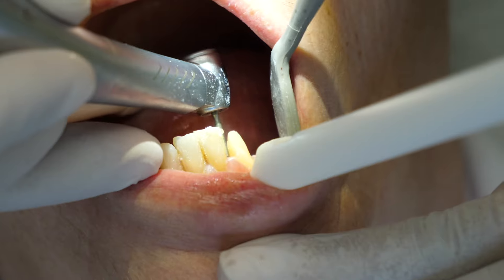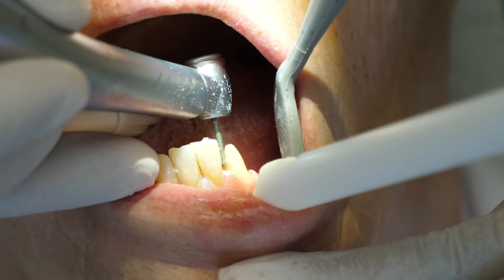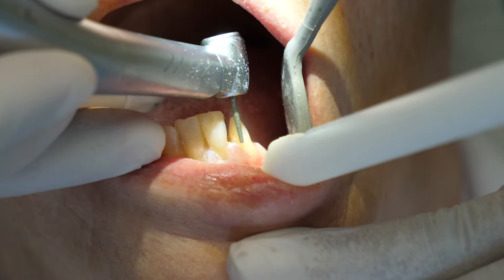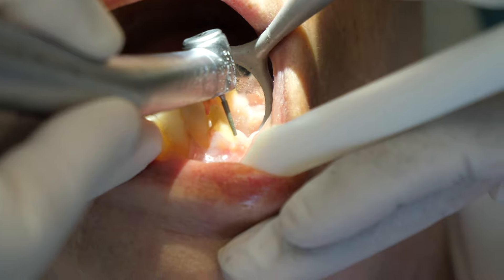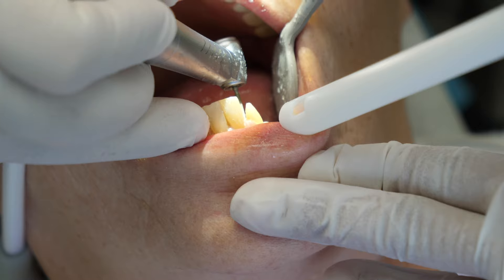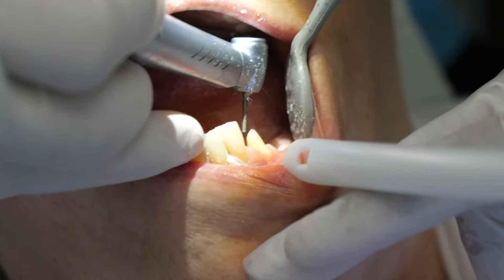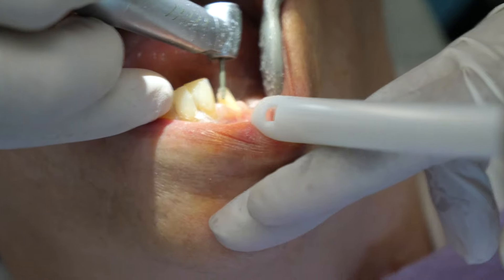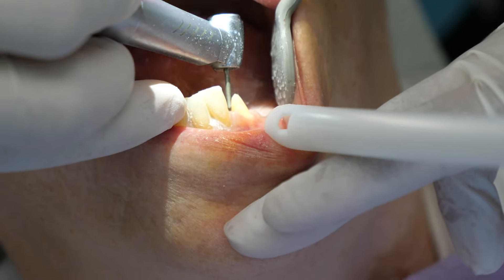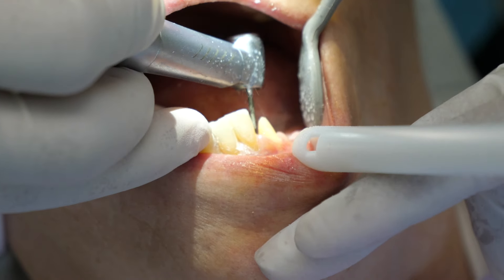Now it's time to prep the tooth. Similar to a cavity filling procedure, the decay needs to be drilled out of the tooth. Once all of the decay is removed, they will prep the tooth for the crown. They shave down the tooth into a shape that will allow the crown to be a cover or cap right on top of it. The shaved-down tooth is starting to look kind of like a little stump, and that's what it will look like for the crown prep.